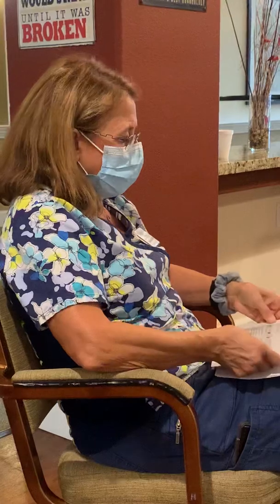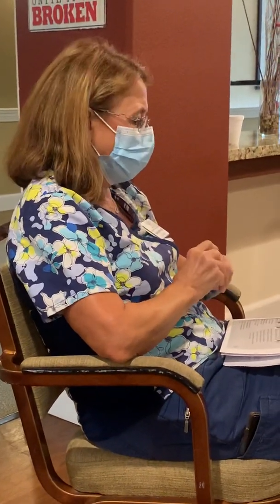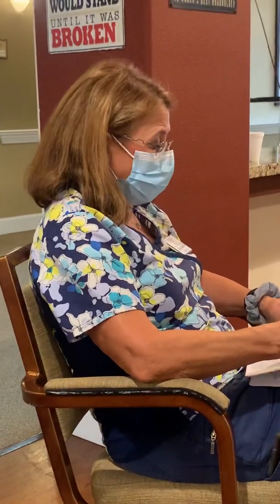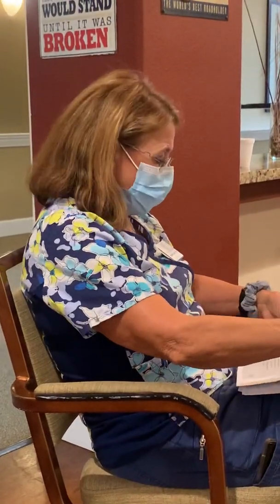So of course, when you do assessment, we're not going to put a Foley catheter in somebody that's incontinent just for our convenience, or if they're immobile, or if it's for obtaining any kind of urine specimens. It should always be ordered by the doctor, always.